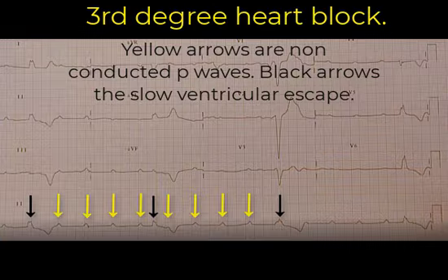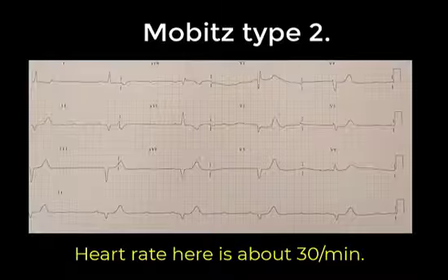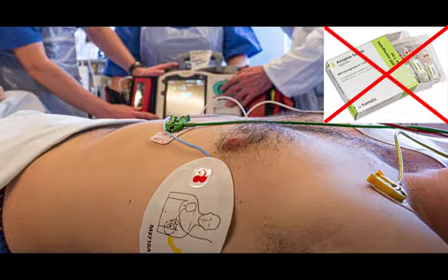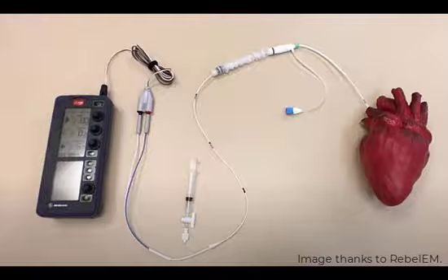Less often, it would be other bradycardic rhythms like Mobitz type 2 or occasionally sinus node pathology. You are doing it as a temporizing measure in someone where atropine has not worked, and after starting it, you're going to take the patient for an urgent transvenous pacemaker.